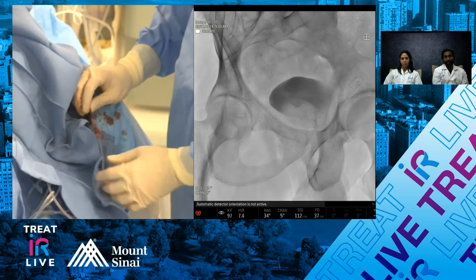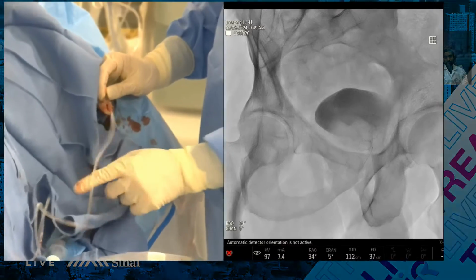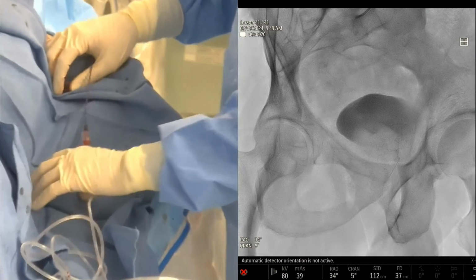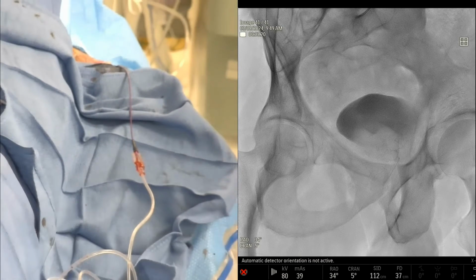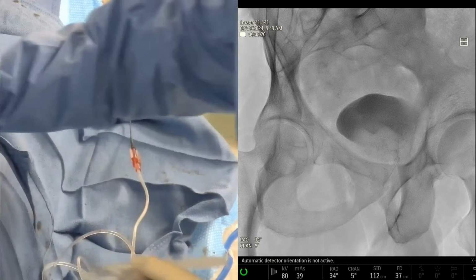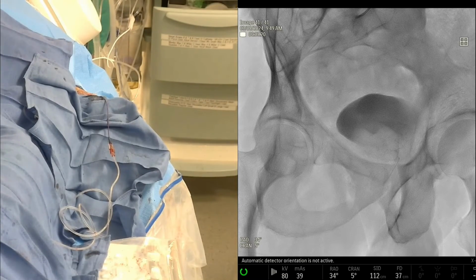Well, that's a great question, because we don't need to with glue. And you saw what we did on that last bit of glue. We put almost like a little plug at the top after we got that distal. And so I try to occlude the parent vessel just with the liquid, so you don't need coils. You can use them, but there's no need because you have so much embolic here that you can use to form a plug. So no, the answer is no, Jay.